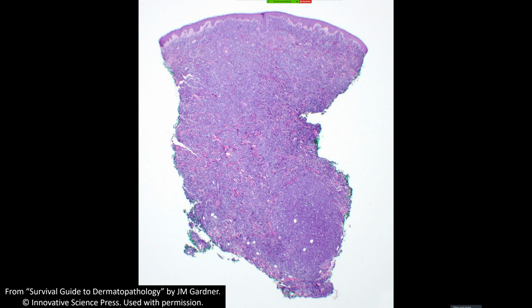So you could say, well, look, this looked a lot like that tumor stage MF. It's just blue cells filling the dermis. And that's true. So when you see blue cells filling the dermis, especially this pattern, diffuse sheets with, I find this really helpful, some strands of the background reticular dermal collagen still intact, what this tells me is these cells are very loose and discohesive. They're not like nests of tumor cells invading between and pushing stuff out of the way and making a bunch of reaction to it.